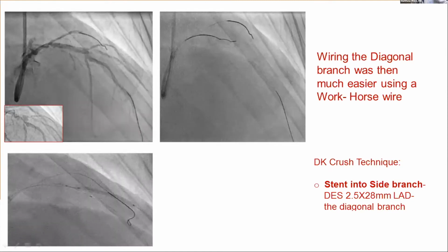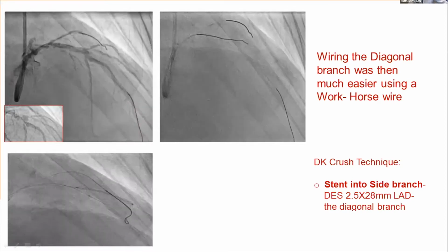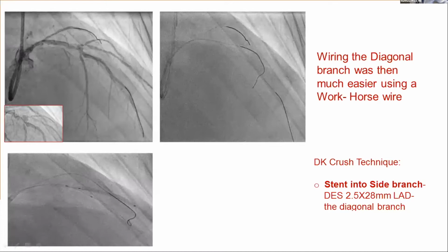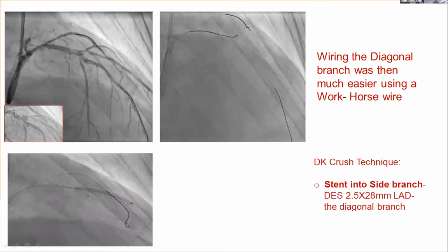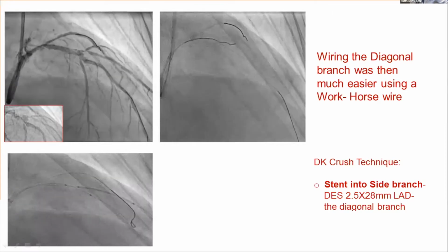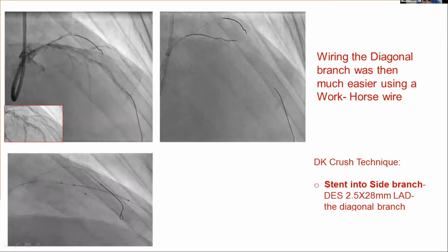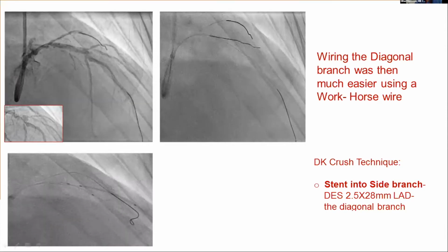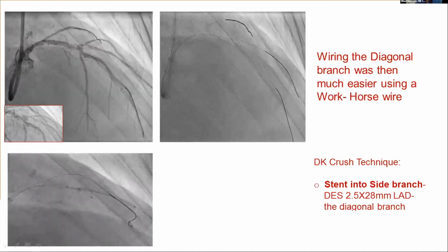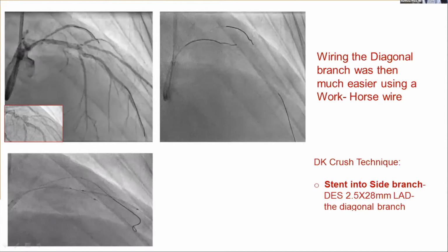I'm sure you got a terrific result, but we're here to grill you and ask you questions. How is a 2.5 balloon possibly going to crush sufficiently in an aneurysmal segment, which is like a 4? If you look at the distal main vessel, this is a compliant balloon, and we took it to quite a high pressure. Let's see what happens. I'll show you what happens.